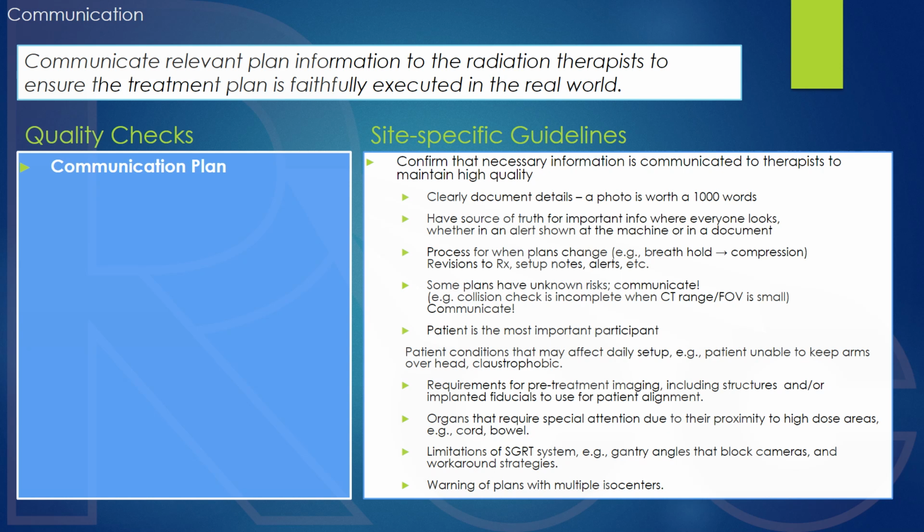Have a process in place for when plans change, and they may. If breath hold becomes compression, or if there are revisions to the prescriptions or setup and notes or alerts, it's important that people know when a change happens and then that they take corrective action. For unusual or complex cases, communicate directly with the therapist and other team members.